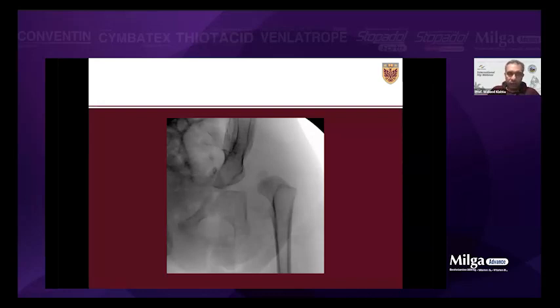What do you think about the tongue shape capsulotomy? Recently, there are a lot of new shapes of capsulotomy: tongue shape, rectangular shape, doing only one cut and getting this over. I'm still with the T. The McDonald retractor is helpful. Yeah, we call it septum here, Dr. Ayman, or Howard's, but yeah, it's a McDonald. How can you determine the site of the vertical limb of the T capsulotomy? I would say 1 centimeter lateral to the labrum, so you don't cut the labrum.